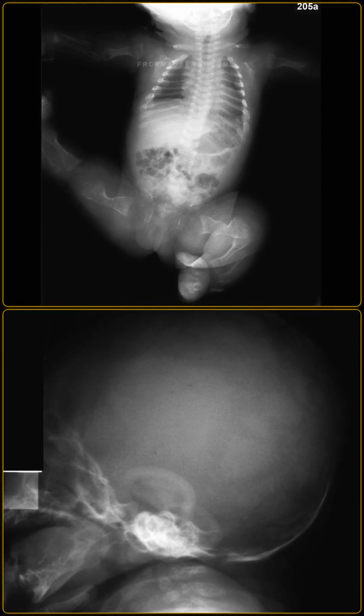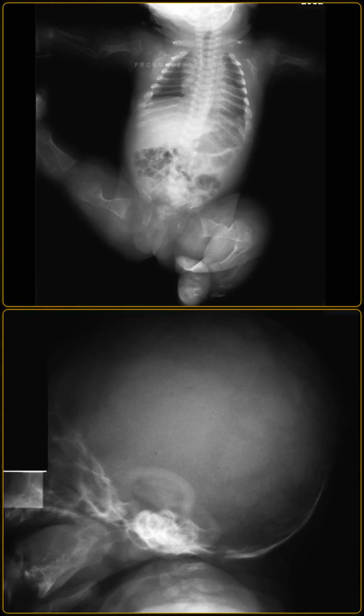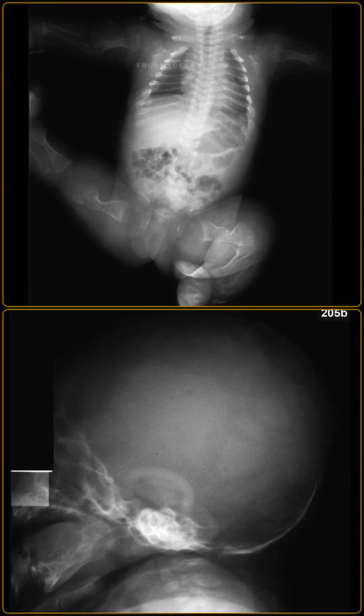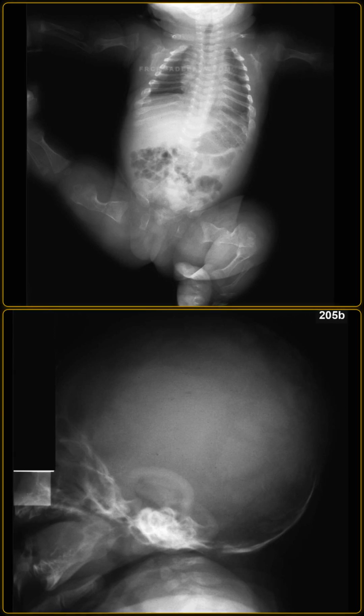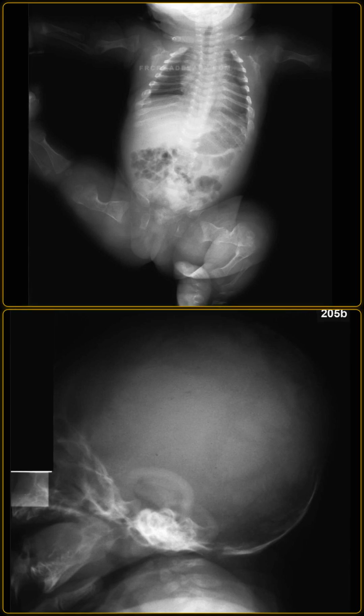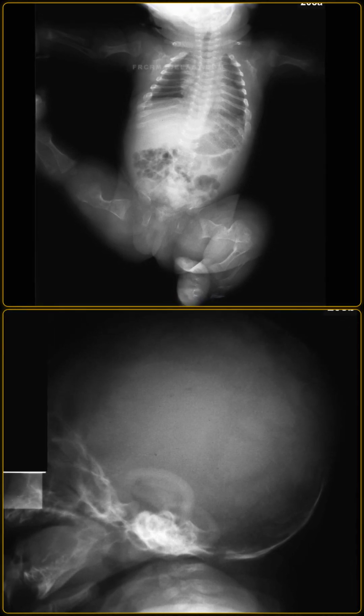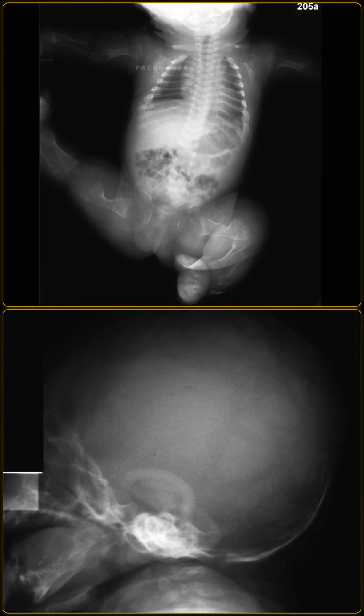How would you manage this patient as a radiologist? As a radiologist, I would document all fractures and compare these films with any prior skeletal surveys to track fracture healing. I would monitor for complications such as basilar invagination on lateral skull or cervical spine views. I would communicate these findings urgently, ensuring that non-accidental injury has been formally ruled out clinically.